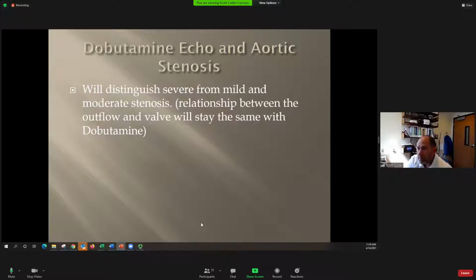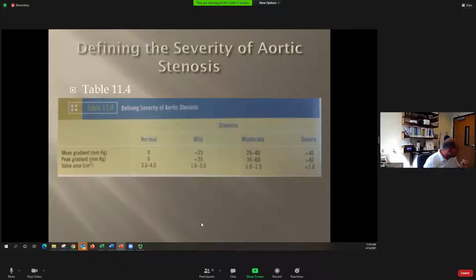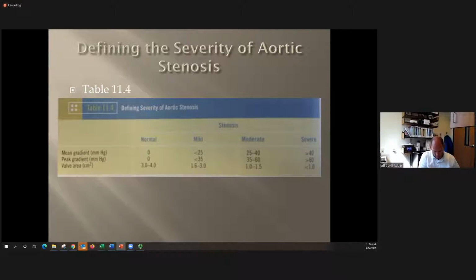So I was looking through the book on the cross-sectional area of the aortic valve, and I was seeing like 2.1 centimeters is normal. Is that different than we were just talking about, like 3 to 4 centimeters? Sorry, I got a little bit lost there. Yeah, I saw that too. What page are you on? 199. Oh, it's talking cross-sectional area. We're talking valve area here, so that's probably why there is a difference. Sorry, I just remember it from the hemodynamics chapter. Right.